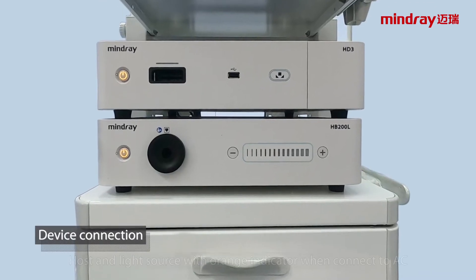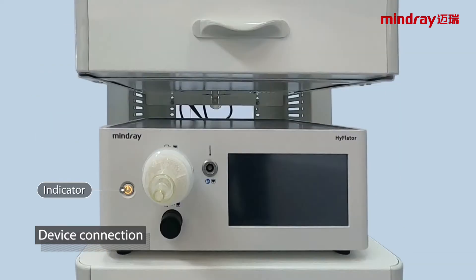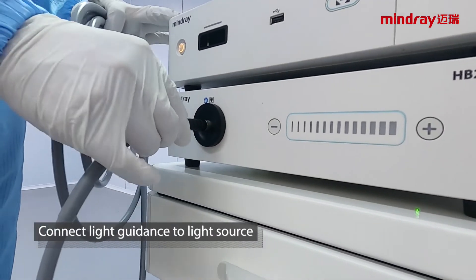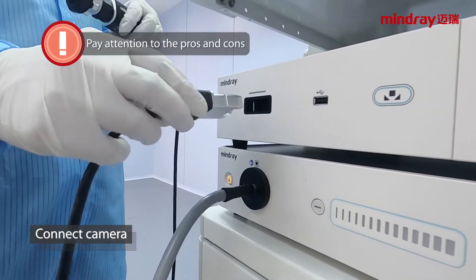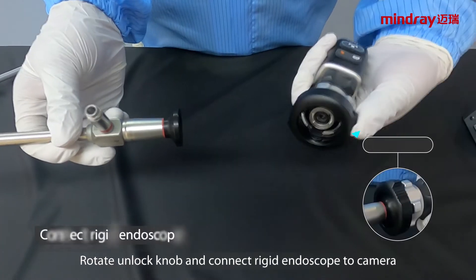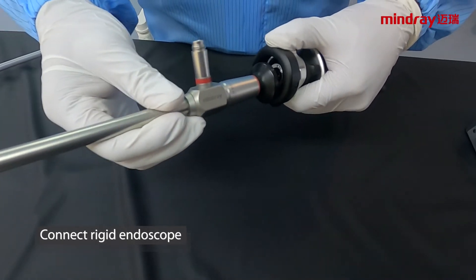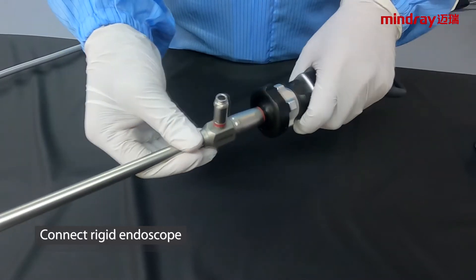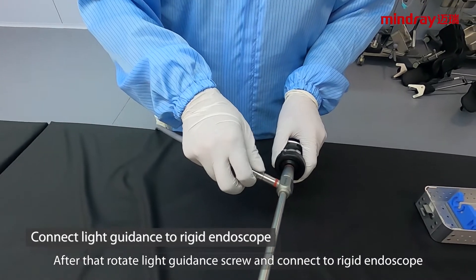Device connection: the host and light source show an orange indicator when connected to AC power. Connect the light guidance to the light source, then connect the camera to the host. Rotate the unlock knob and connect the rigid endoscope to the camera. After that, rotate the light guidance screw and connect it to the rigid endoscope.